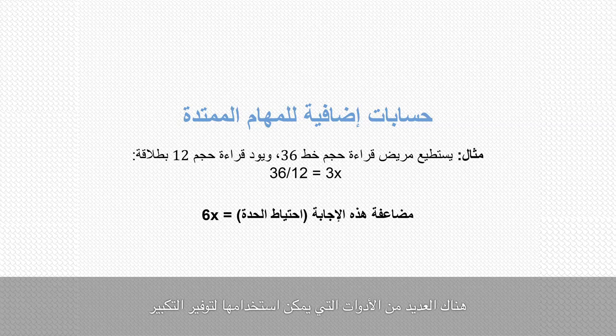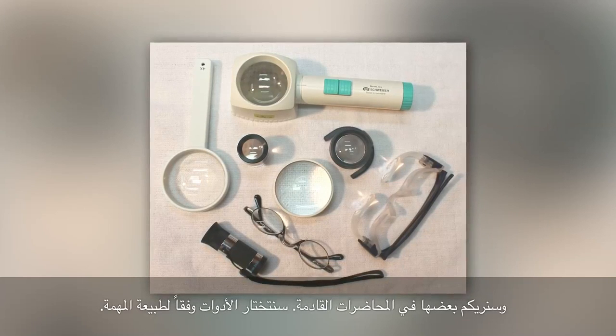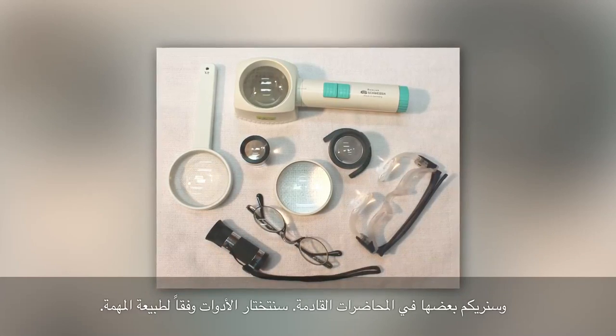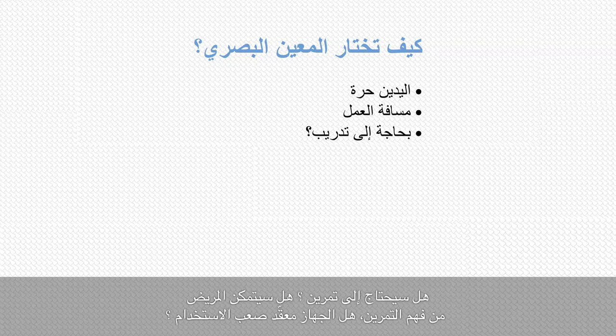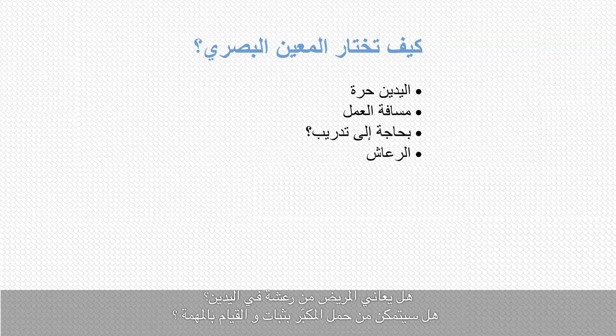Now, we've got several aids we can use to deliver this magnification, and over the course of the next few films we'll show you some of these aids that are available, and we'll select them depending on the nature of the task at hand. Does the patient want their hands to be free so they can hold the text? Is the task working distance important for the patient? Is training going to be needed? Is the patient going to be able to understand the training? Is the device quite complicated to use? Does the patient have a tremor? Will they be able to hold the magnifier and the task steady?